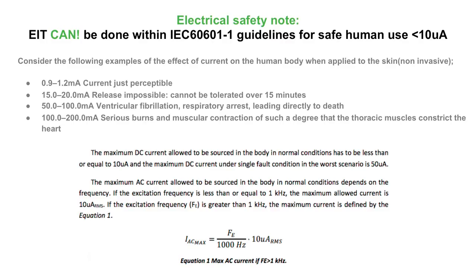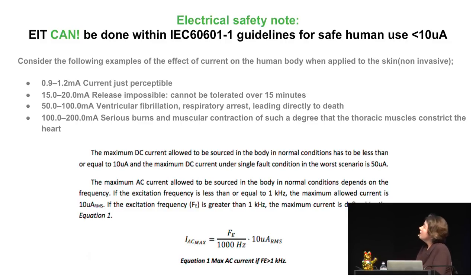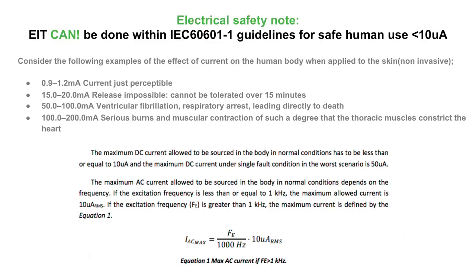At this point, you might be asking, is this safe for me to play around with, which is a really great question, because the answer is actually, yeah, it is. There are some guidelines called the IEC 60601-1 guidelines for safe use in humans, which say the current should be, and OpenEIT is, less than 10 microamps, which is great, because that's well within their guidelines. If you want to compare it to other things that are completely legal, say, I don't know if you've seen those late-night TV ads for those ab stimulators that stimulate your muscles. They're about 15 to 20 milliamps, just for reference, and as a scale to look at the 10 microamps. So some of you might have used them already. And that's hugely more current than what we're putting through to image the body here.